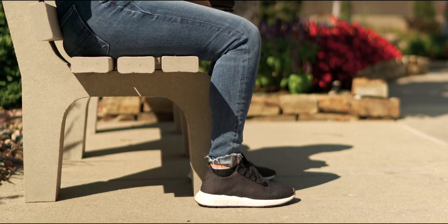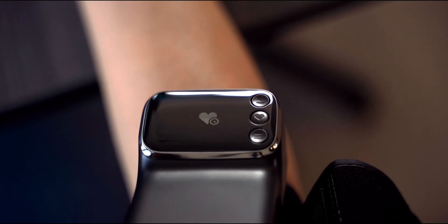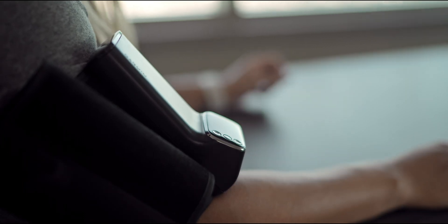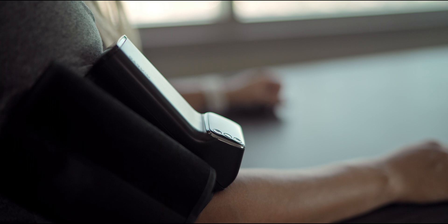The Indexed BPM cuff should be snug but comfortable. Sit down with your feet flat on the floor. Place your arm on a table or flat surface and press any button to wake up the device. If you wish to take a single measurement, press the heart icon when it appears. The arm cuff will automatically inflate and deflate with your results appearing on the display when finished.